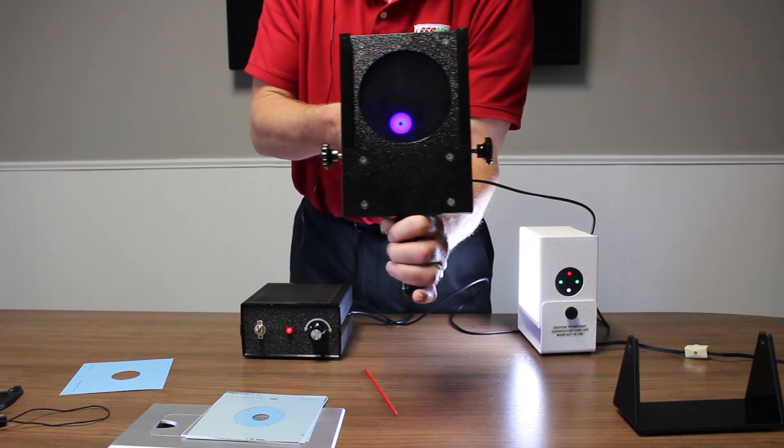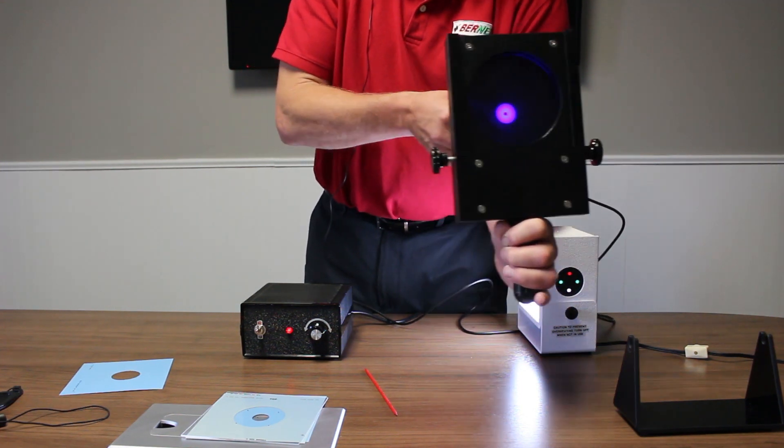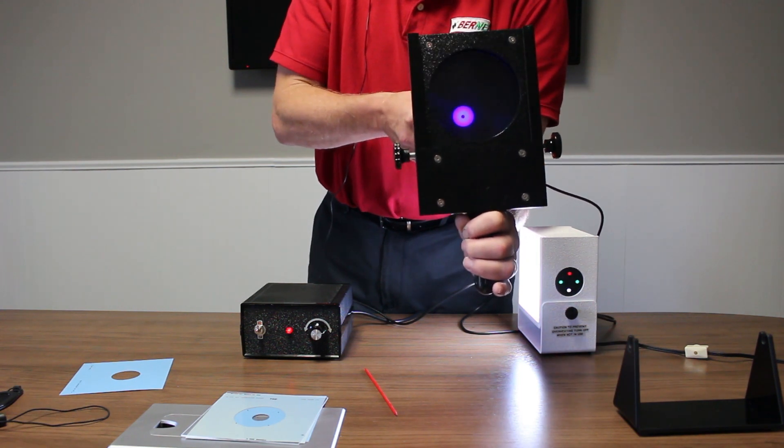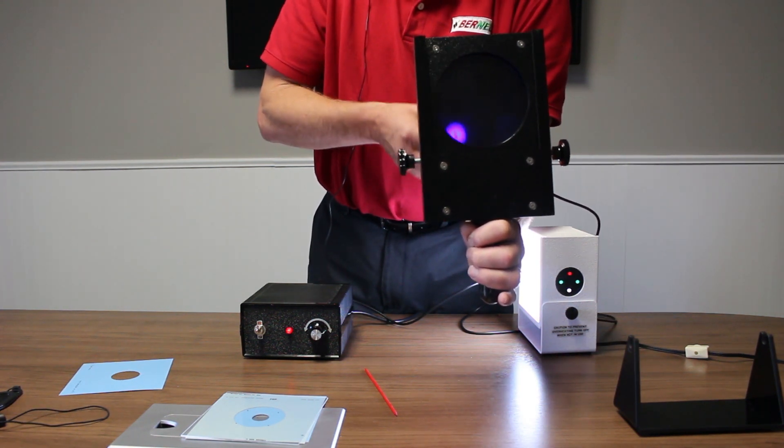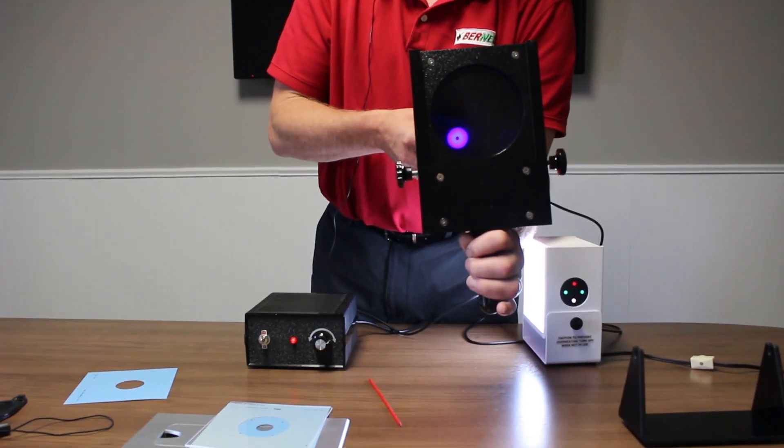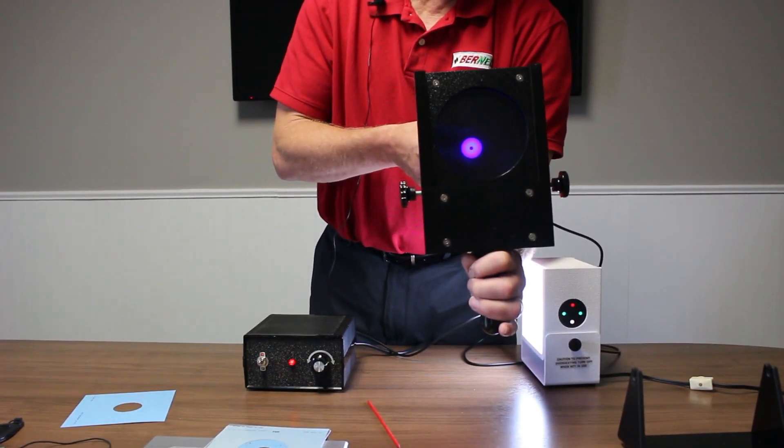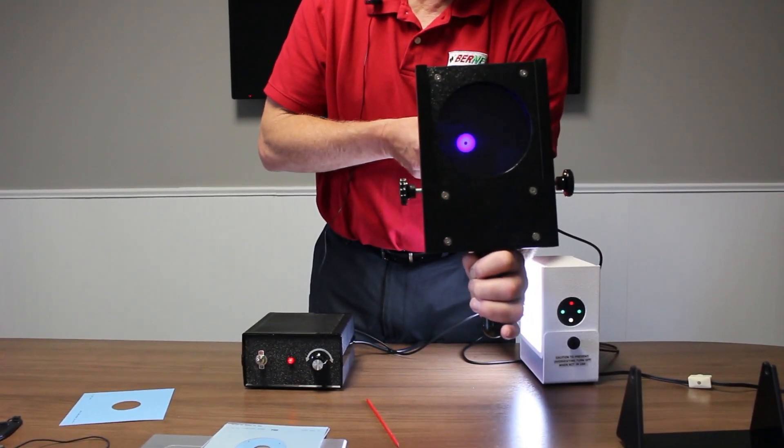We can have the patient stand, we can have the patient on a balance board, we can have them look at very different positions around the room. One can even set up multiple light sources and have them look at those across the room, but they have to be very bright light sources to work.